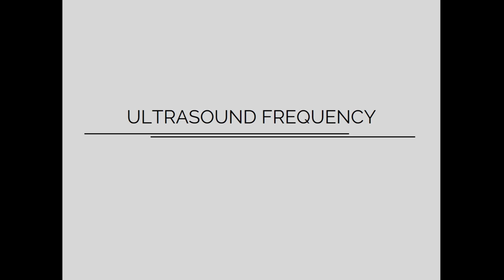First, I would like to talk about the ultrasound frequency. Ultrasound frequency is very important to understand because, if we divide it, there are basically two types of frequency, high frequency and low frequency. The higher frequency ultrasounds are good for superficial structures. For example, if you have to do the ultrasound of the breast, you have to go with the higher frequency ultrasound because it does not go into the deep structures, okay?